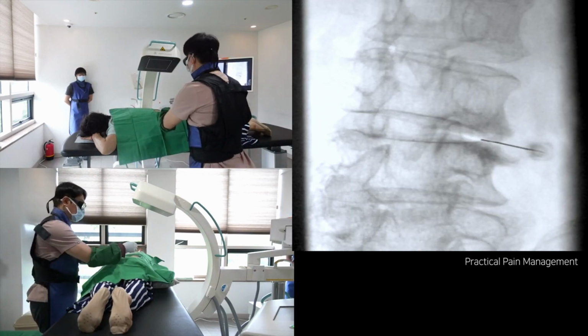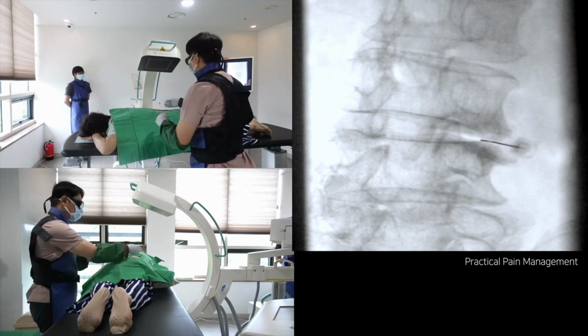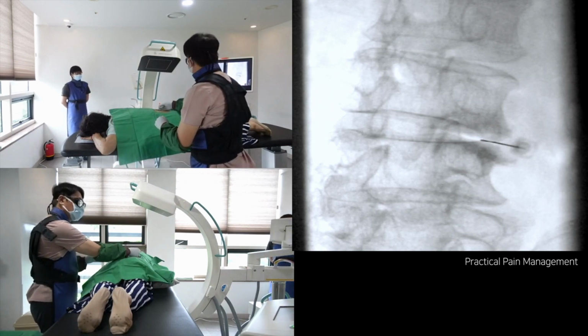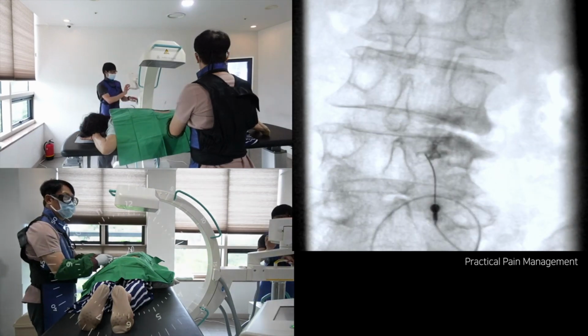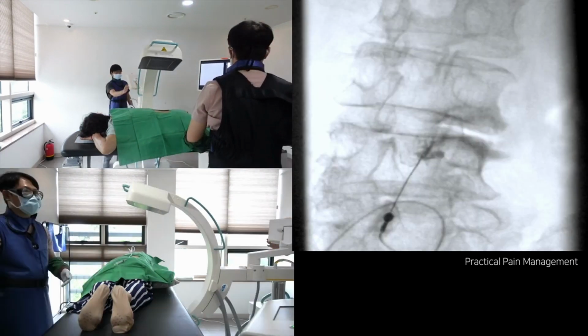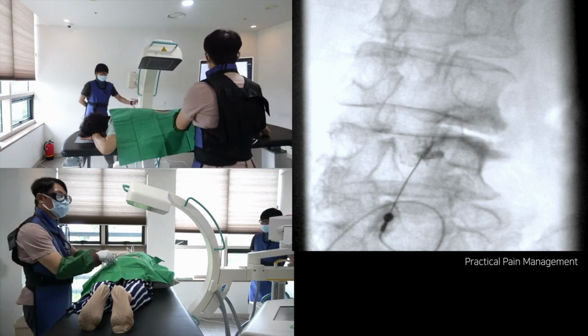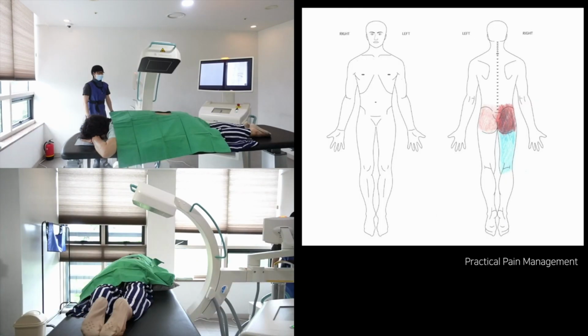Next, I'll demonstrate a more complex case involving an intradiscal injection via the right L3-4 Kambin's triangle and an L3-4 facet joint injection, using 50 units of Botox with triamcinolone. This is intended to alleviate pain originating from the L3-4 subchondral bone marrow and the L3-4 subarticular stenosis. The pain diagram of the patient suggests that the discomfort in the buttock arises from the discovertebral complex.